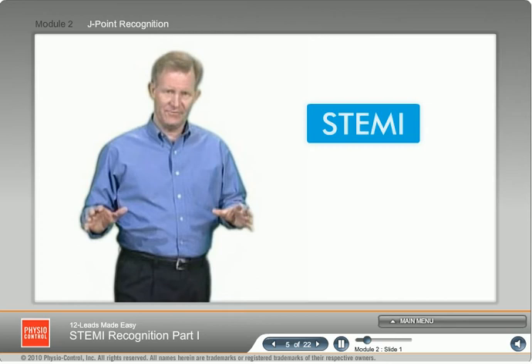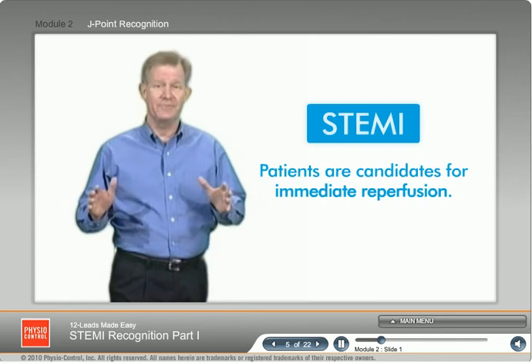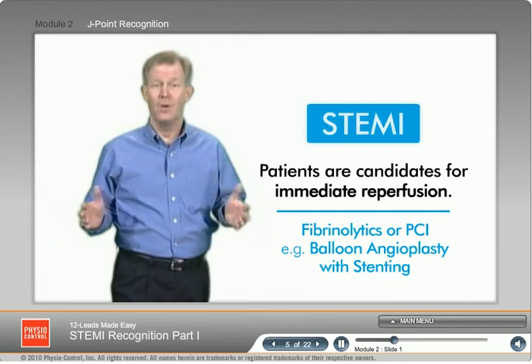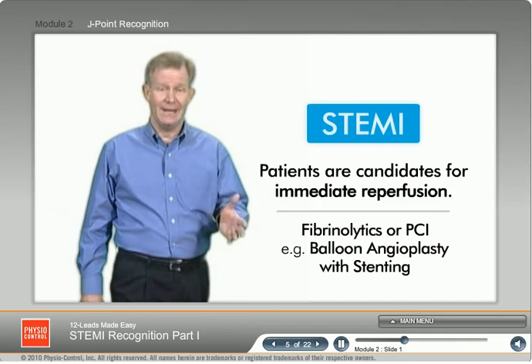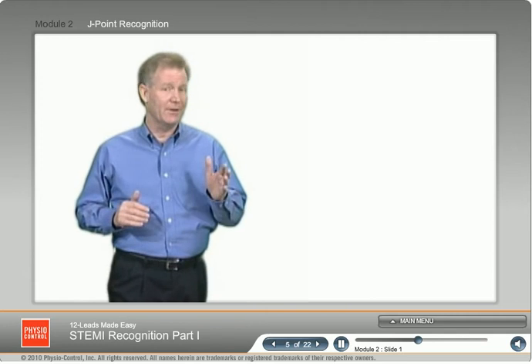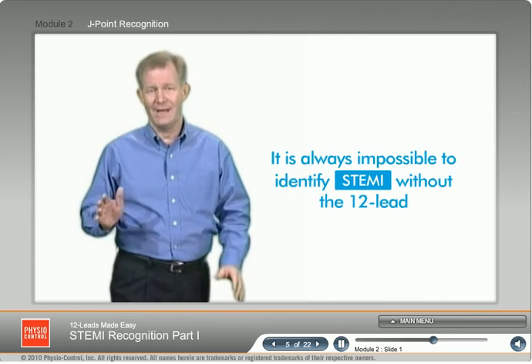The acronym STEMI stands for ST elevation myocardial infarction. STEMI patients are candidates for immediate reperfusion. That is, candidates for either fibrinolytics or PCI, usually in the form of balloon angioplasty and stenting. While in some cases you can recognize myocardial infarction by the clinical presentation alone, it is impossible to identify STEMI without the 12 lead.